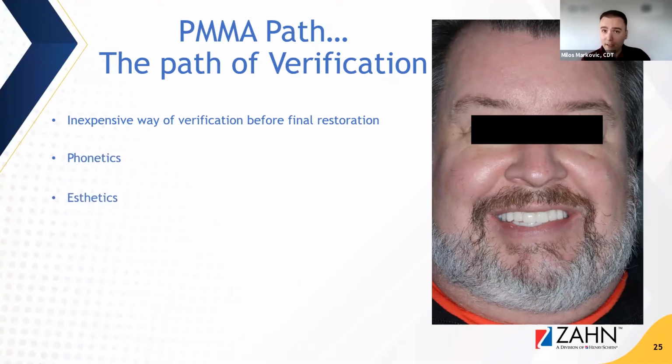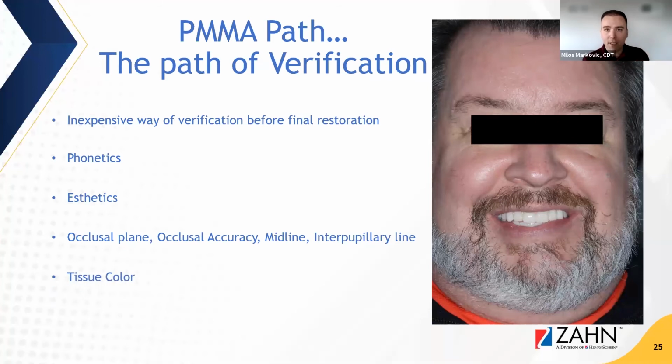So we verify phonetics, aesthetics, we verify occlusal plane, interpupillary line, the midline, everything that you need to make sure that that case is done right.